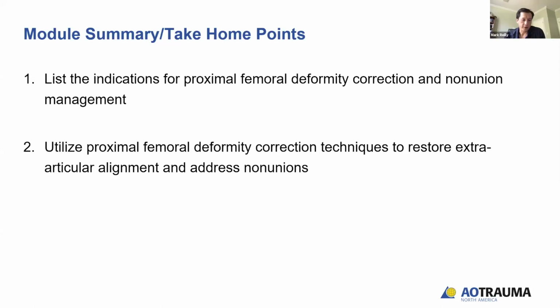That's been my experience, that when I skewer the trochanter, cannulate the trochanter with the blade, if I don't protect it, particularly for a significant valgus, the trochanter seems to have a very high incidence of fracturing around the blade.